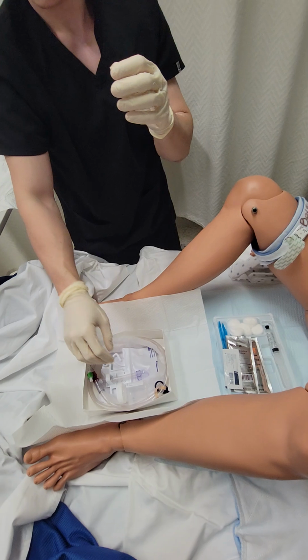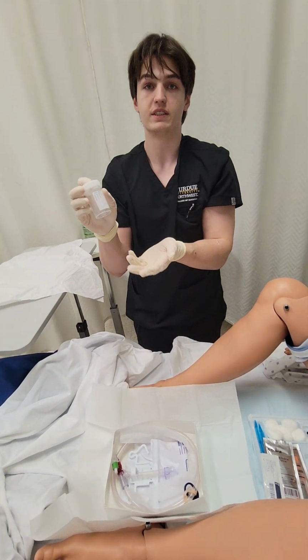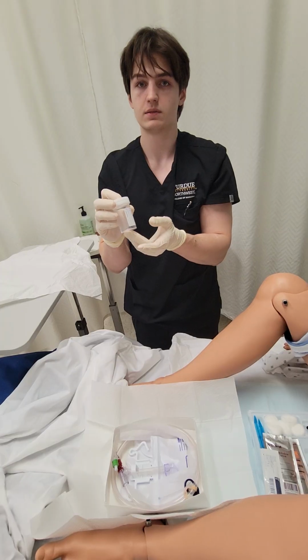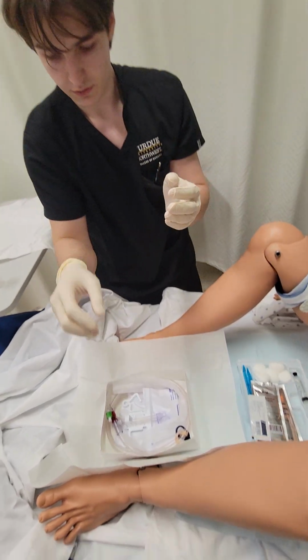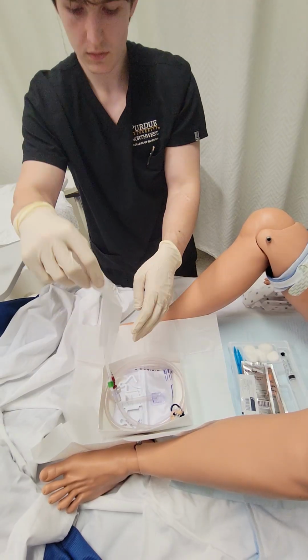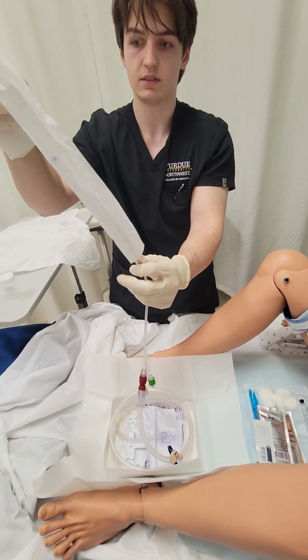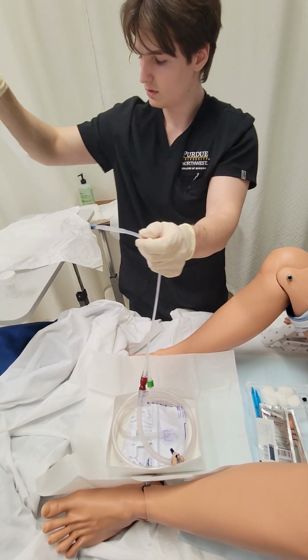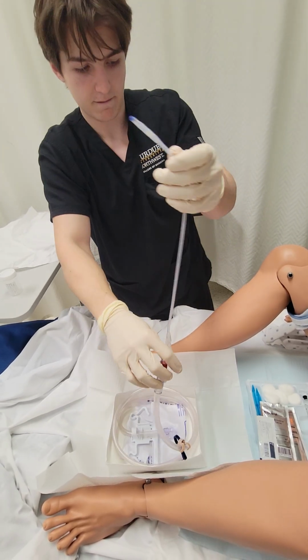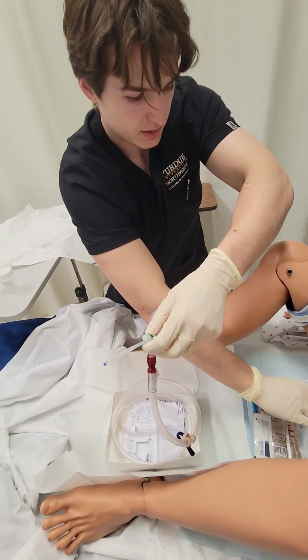All right, next, this will be used for a urine sample. A urine sample can only be taken out of the Foley bag immediately after it's inserted. Setting this here for the time being. Pull this out. I'm going to drag along this so it doesn't start flying around all crazy. Okay. Now I'm going to grab my saline.